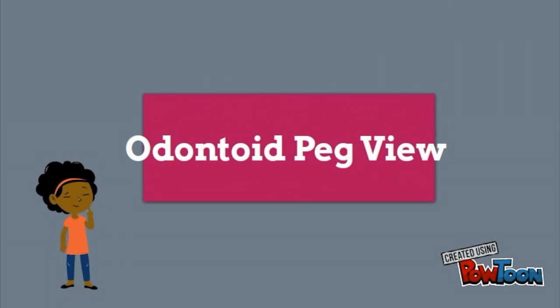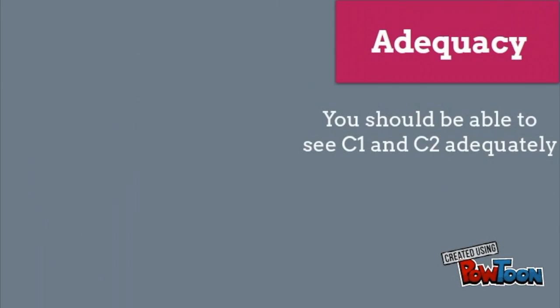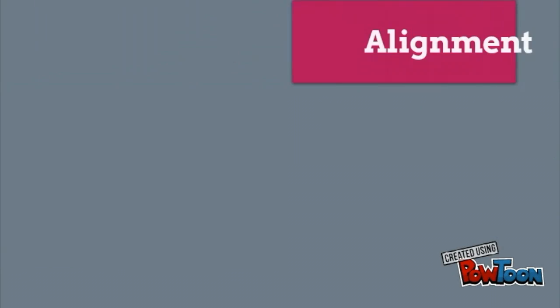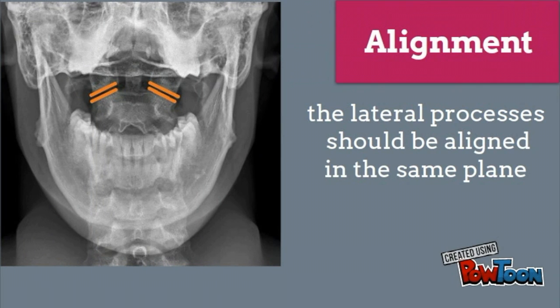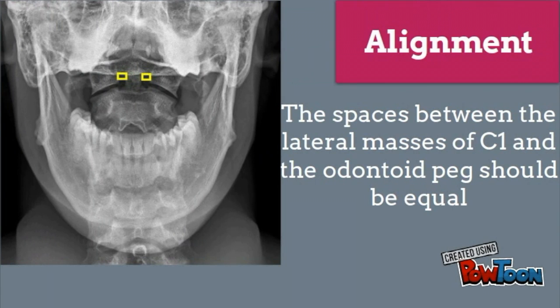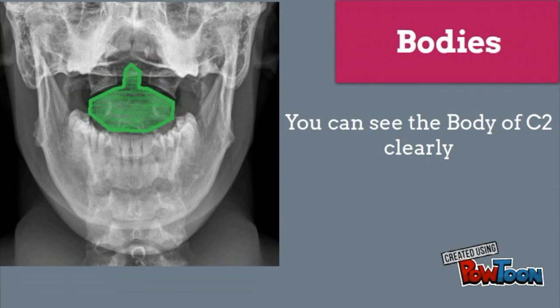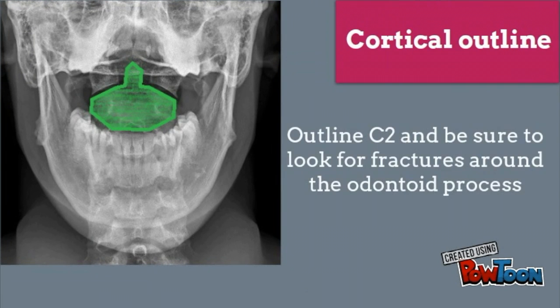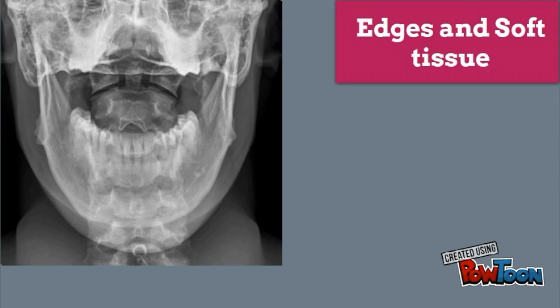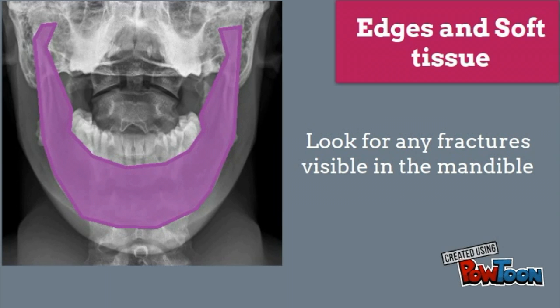Odontoid peg view. Adequacy: you should be able to see C1 and C2 adequately. Alignment: the lateral processes should be aligned in the same plane, and the spaces between the lateral masses of C1 and the odontoid peg should be equal. Bodies: you can see the body of C2 clearly. Cortical outline: outline C2 and be sure to look for fractures around the odontoid process. Edges and soft tissue: look for any fractures visible in the mandible.